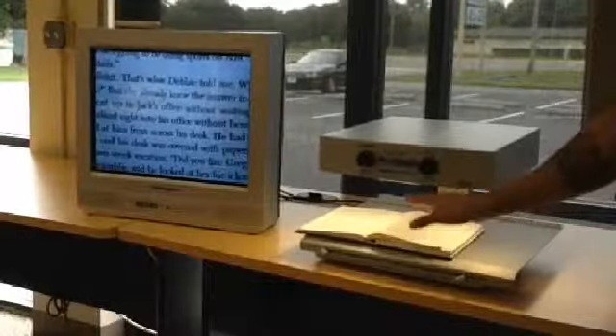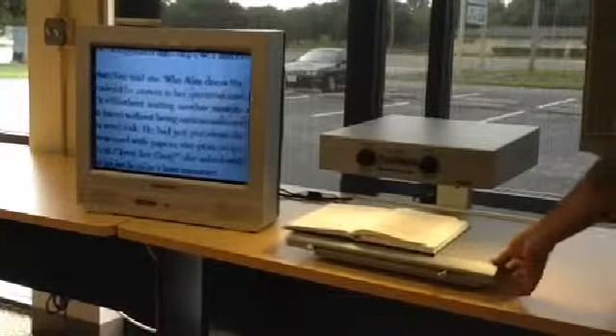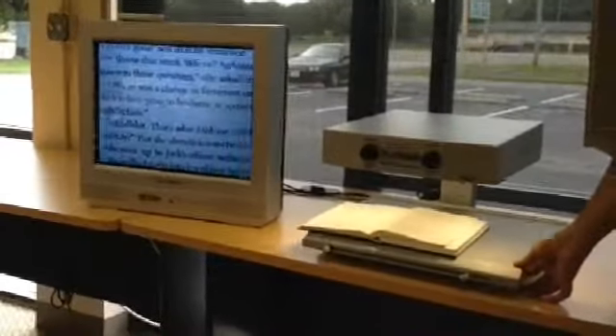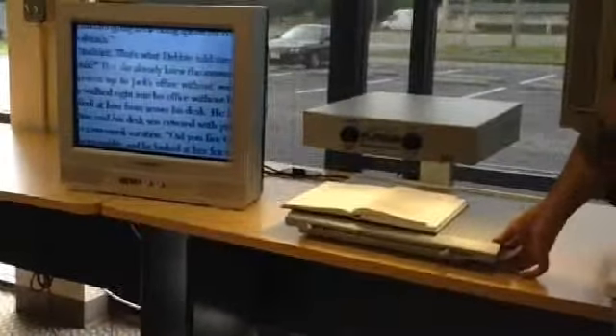Seven inches of clearance between the camera and the actual table, which allows for reading and writing. Hobbyists and craftsmen can work with the device as well.